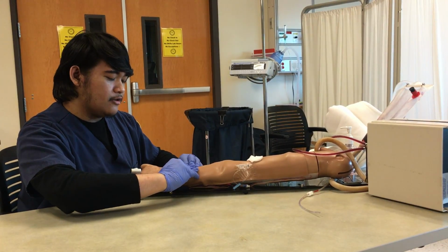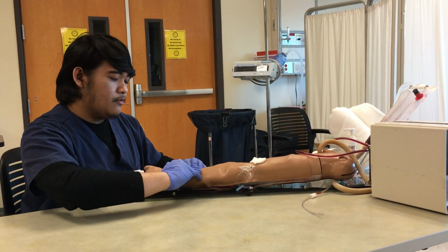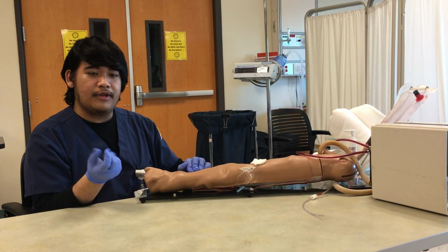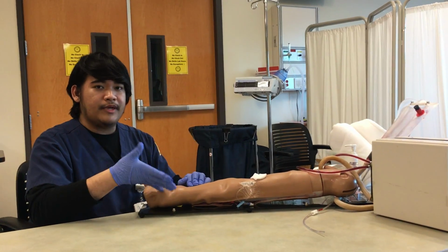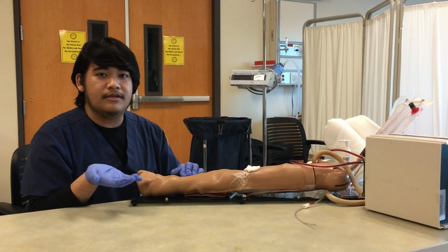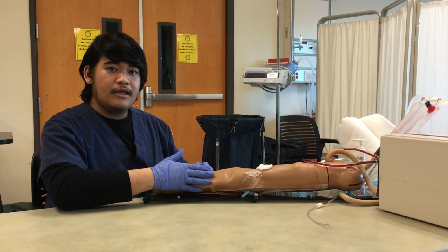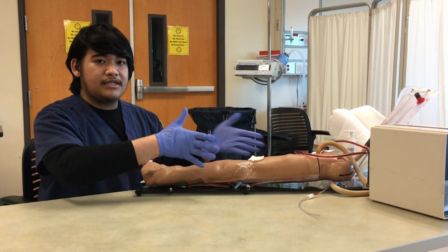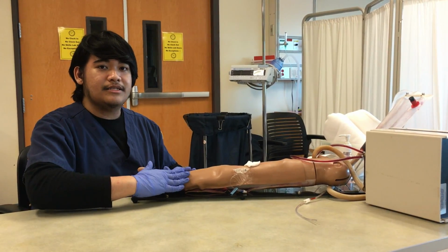Once we see discoloration, no pink color and it's turning white, we let go of the ulnar, and we ask the patient to stop pumping. We want to see color come back into the hand. If it fails to do that, we would go to the other arm because this arm failed the modified Allen's test.